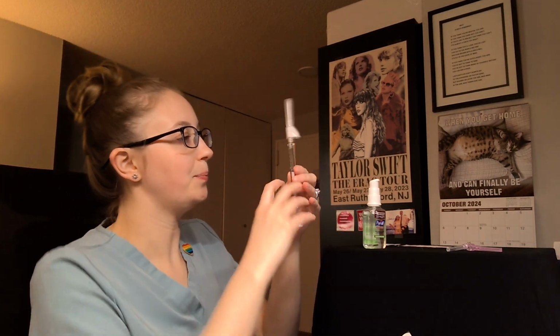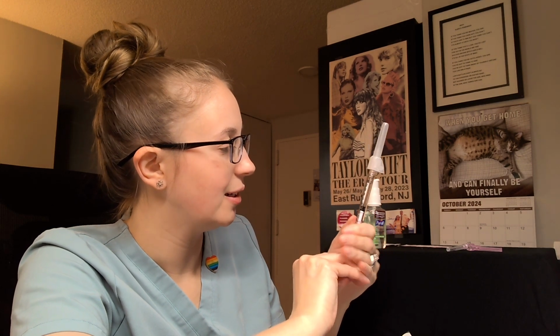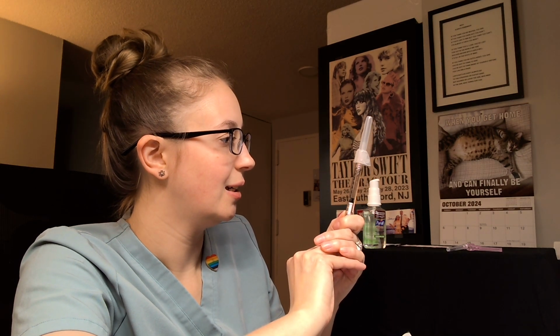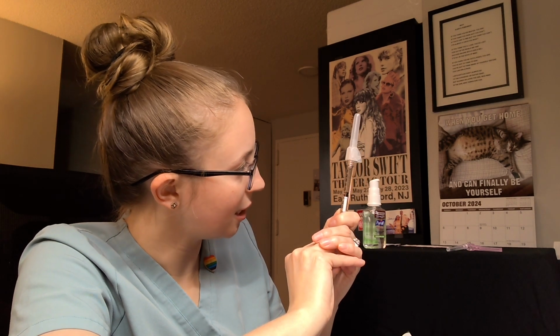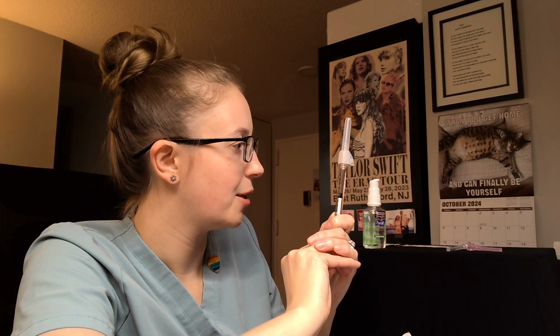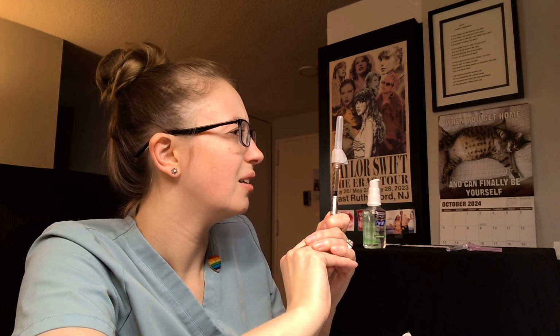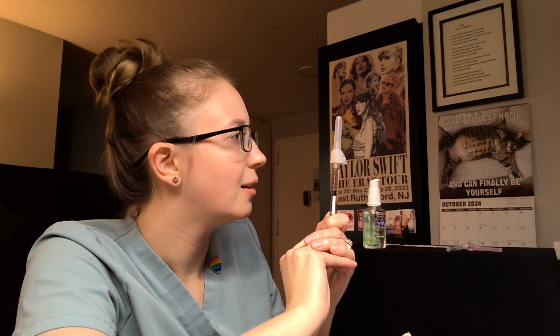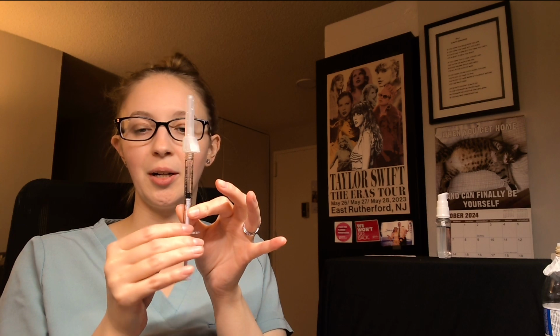Once your bubble's at the top, you're going to push up, and I recommend keeping the cap on so you don't accidentally squirt yourself. You're going to push up until all the air is out of the syringe. Takes a little bit of practice. This part's tricky. And sometimes when we do this, we do have to go back and get more medicine. So I push it all the way to the top. And then you'll see a little bead of medicine come through. So you have your medication all drawn up, your air bubbles are out.